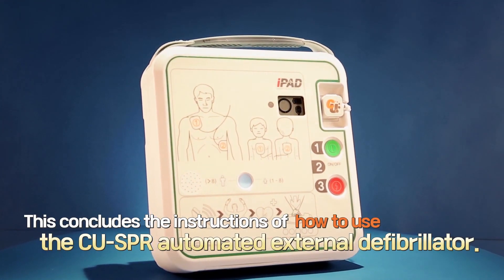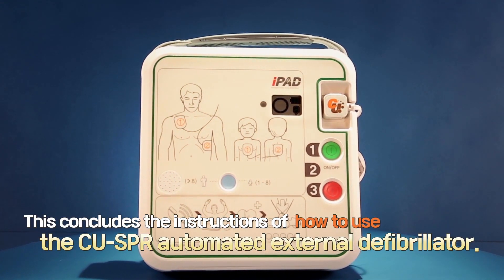This concludes the CUSPR Automated External Defibrillator introduction.